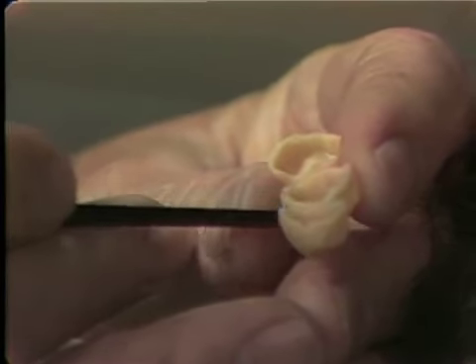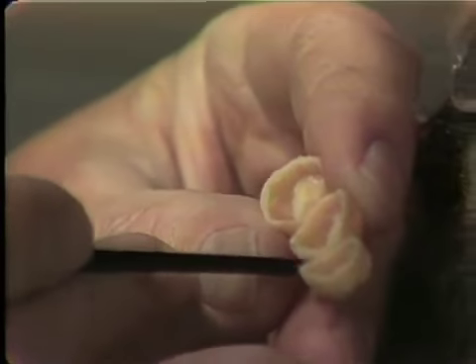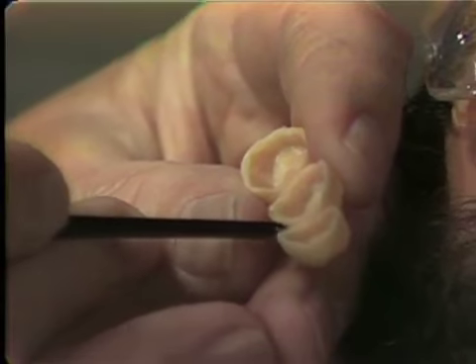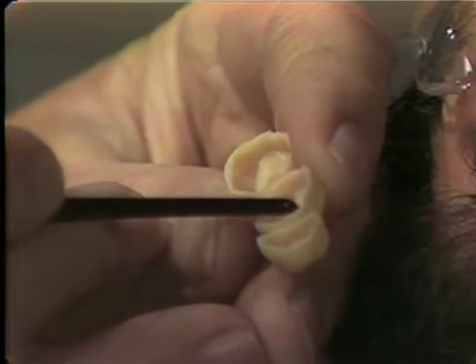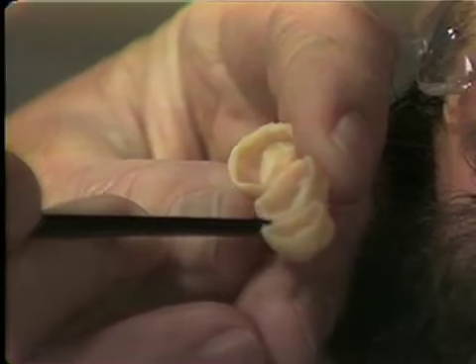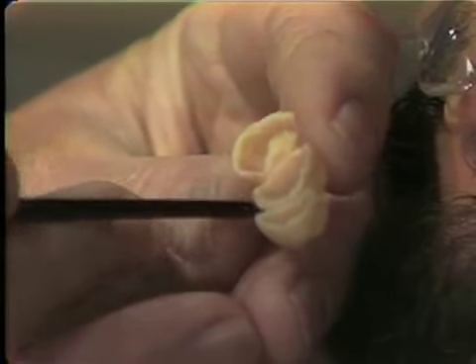This is an area where we prevented the patient from going between the teeth with the dental floss, and could cause some periodontal problems between these teeth. So open the embrasure so the patient can get in there with the toothbrush and keep this area clean.